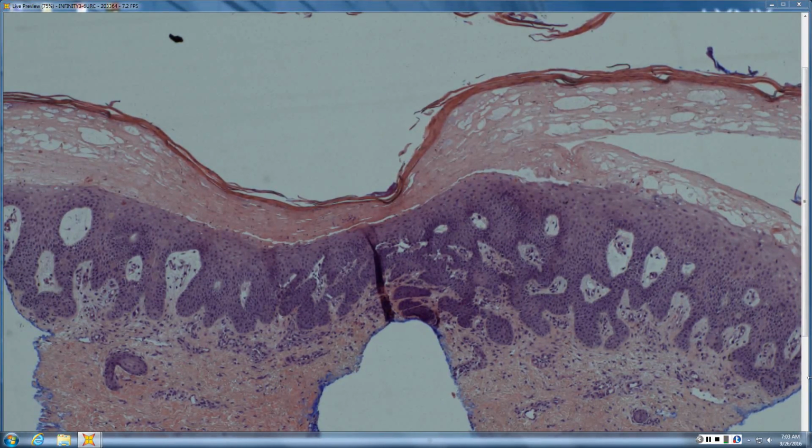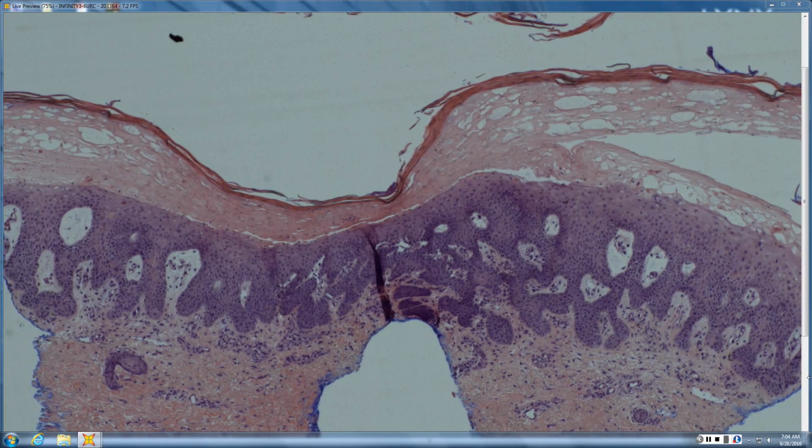And so by looking at this cut and the findings here and saying it's nutritional derm, that doesn't point out what is deficient. So glucagonoma, pellagra, acrodermatitis enteropathica, they all produce kind of the same dermatitis. But usually when it gets biopsied, unless it's been there for a while, it's just a non-specific dermatitis. There's not really a whole lot that's going on. But if it's been there a while, you then start to see this pallor. And essentially what's going on here is you get this somewhat compact stratum corneum, which is the top part here. That always means something that's kind of subacute, almost chronic. It's been going on for a while.